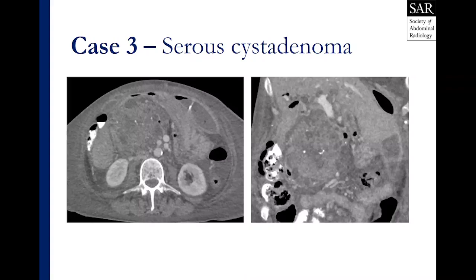To illustrate a point: serous cystadenomas can grow quite large and cause symptoms. This is a patient who had been followed for several years with a serous cystadenoma that slowly grew to become quite large in the right mid-abdomen. This is a pancreatic head serous cystadenoma with coarse calcifications visible on the axial and coronal post-contrast images. The patient developed chronic abdominal pain and eventually the surgeons performed a Whipple procedure, and the patient did quite well.